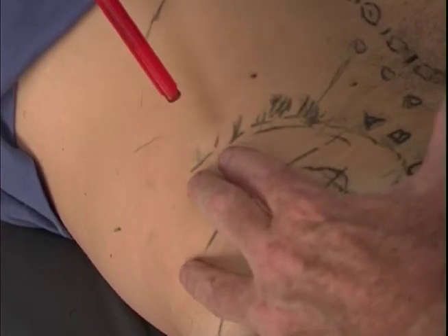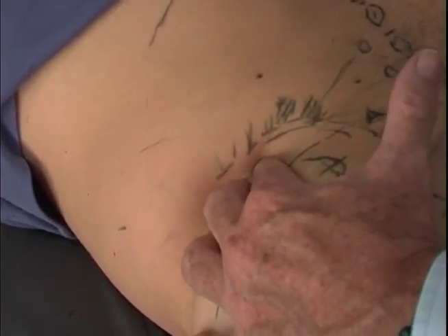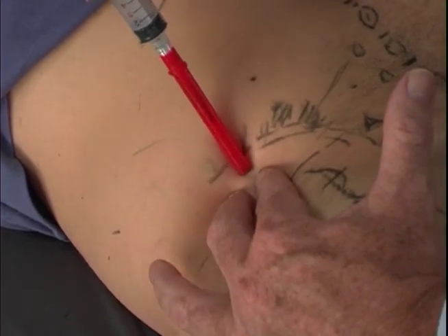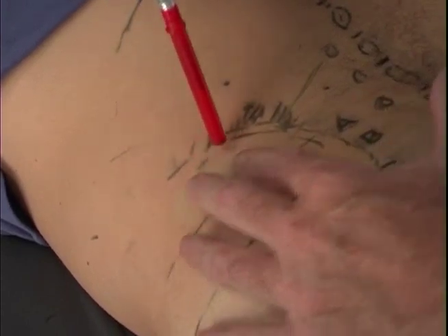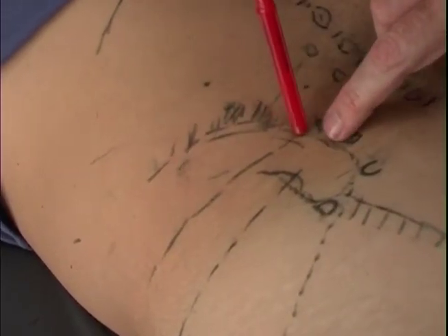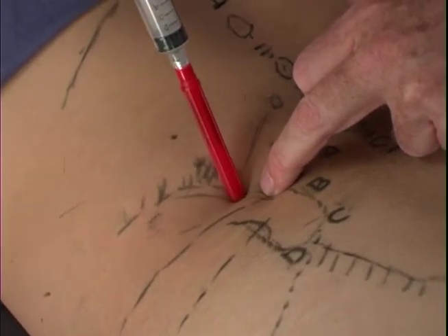When you get down into this area of the ilium, then we do again skin compression onto the ilium and come down with our needle onto the top of the ilium, hitting the iliolumbar fascia that runs all the way along the ilium in this area.